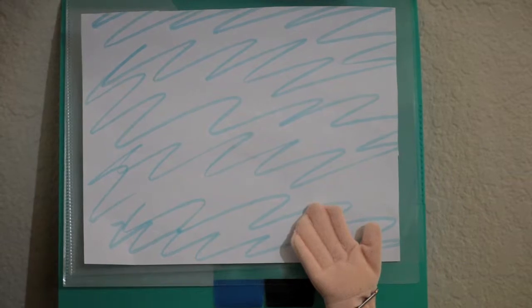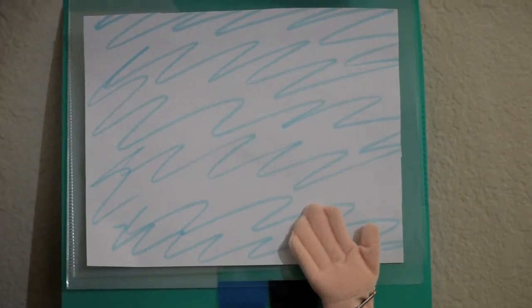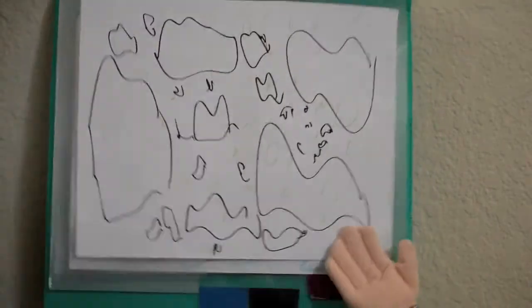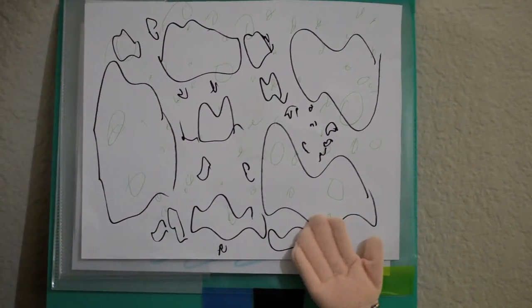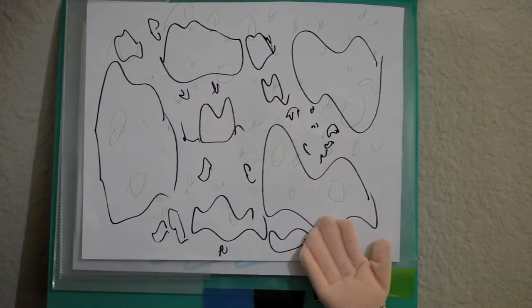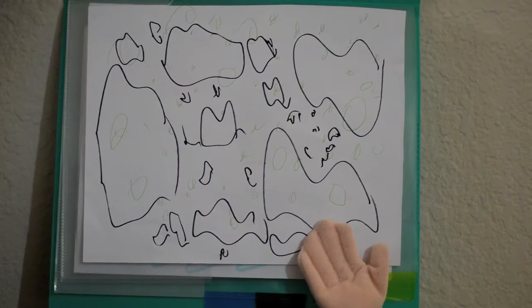There is a base layer that is tinted blue or blue-gray, and it is coated on one or both sides by emulsion. Emulsion is the active layer on the film and contains crystals of mostly silver bromide. During development, the crystals that were exposed to light turn black after processing, and the remaining silver is washed away.